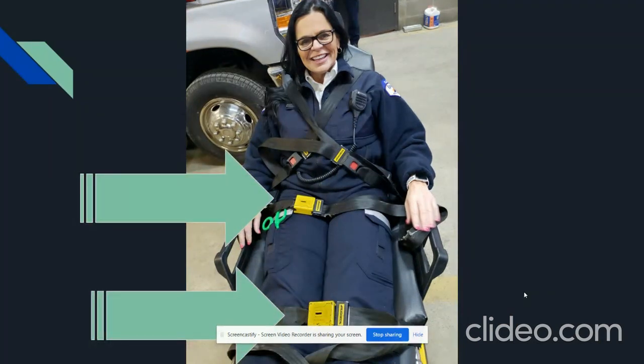As you can see, the buckle guards are placed. They're relatively easy to place. They're very secured on her, as you see it right there. Again, depending on the issue that you are dealing with, you may want to place them in different spots.